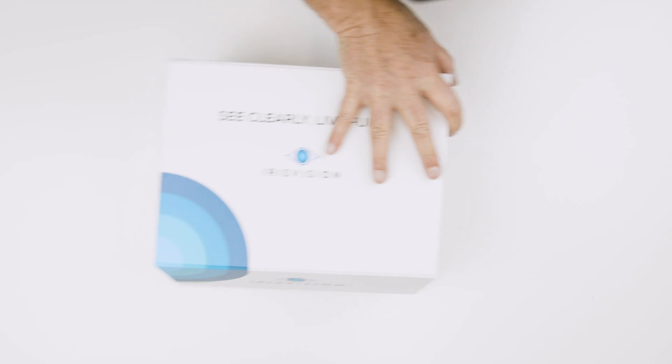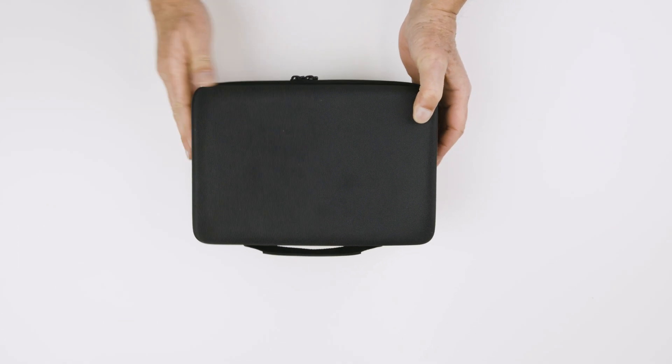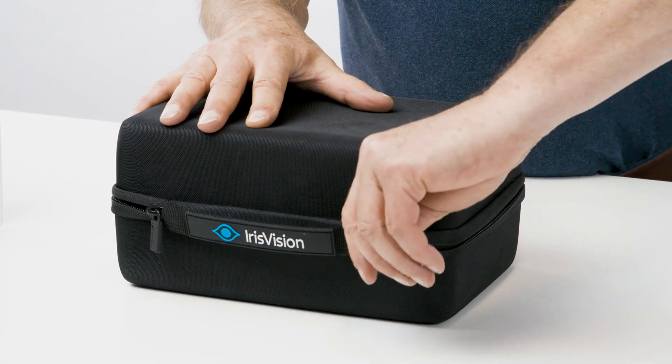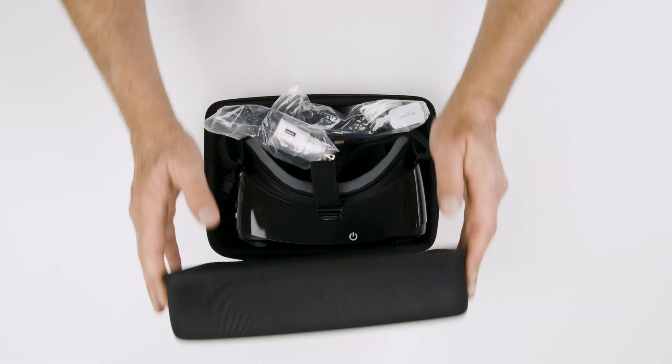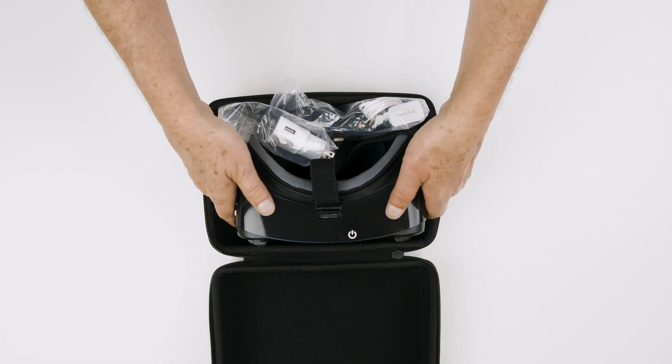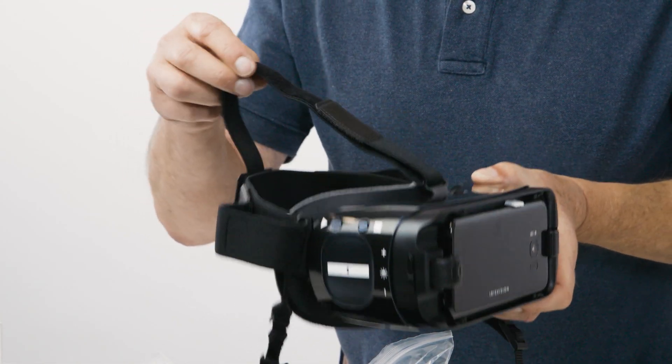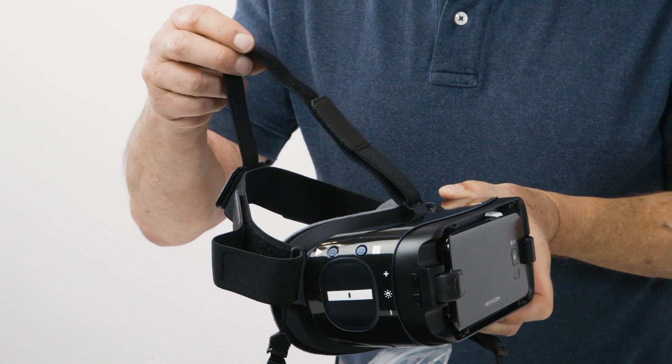This is the Iris Vision carrying case. Inside you will find the headset and charging equipment. This is the Iris Vision unit. You will notice there are straps attached to the unit — these can be adjusted to fit your head.